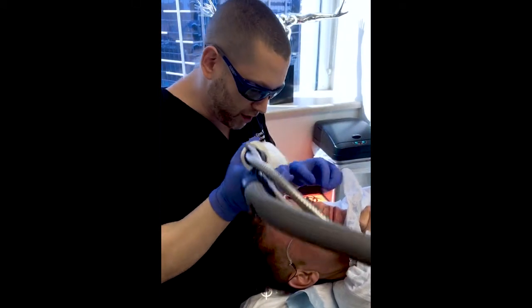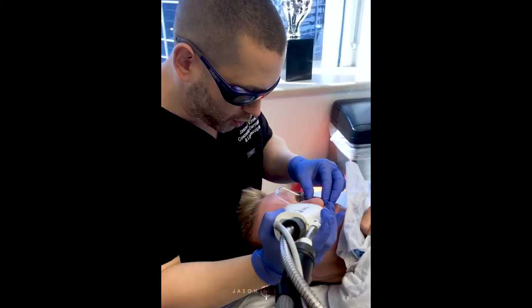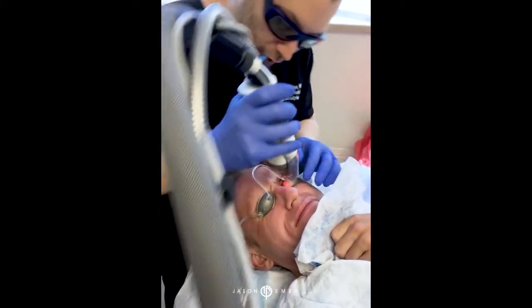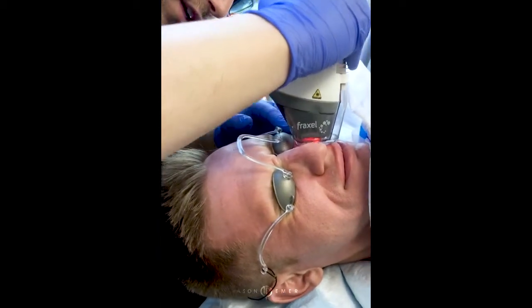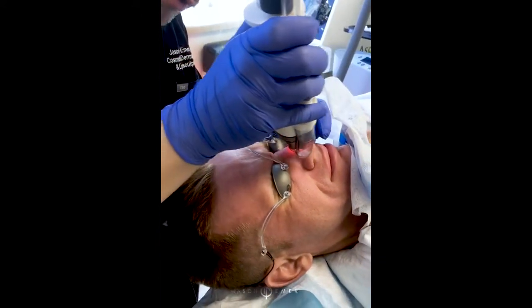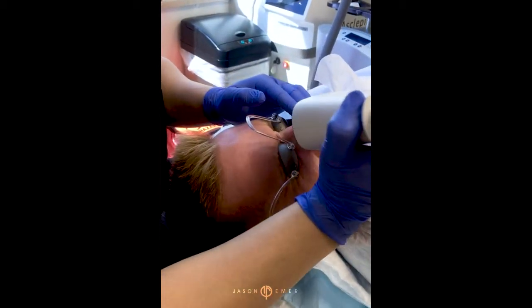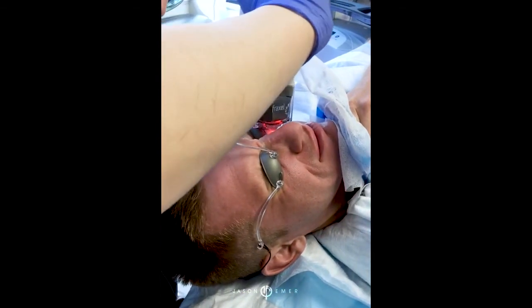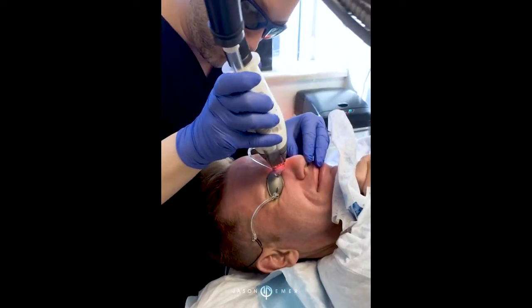Also, to do some bigger procedures, and we talk frequently about the use of lasers to prevent skin cancers. I posted about it this week, doing it on a person's back. We're now doing that same laser, the Fraxel, to just resurface a young guy's face, and this is something he does consistently for anti-aging, but also because he's blonde and blue, he gets sun damage very easily and is at high risk of developing skin cancer. So for preventative maintenance, he's doing really, really well. He's doing a consistent every few months Fraxel, which is what I do to keep him young and good looking, but also prevent any issues with the skin.